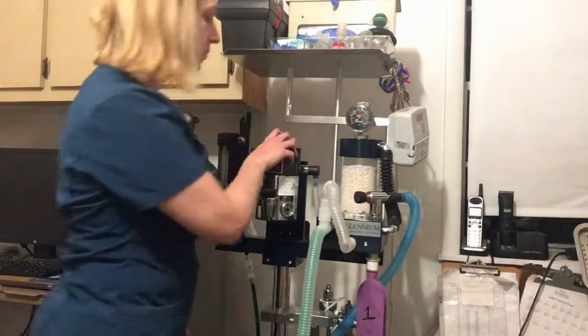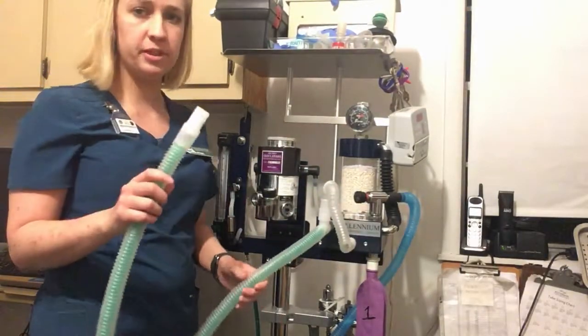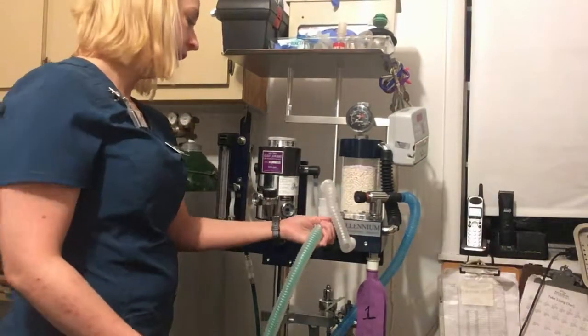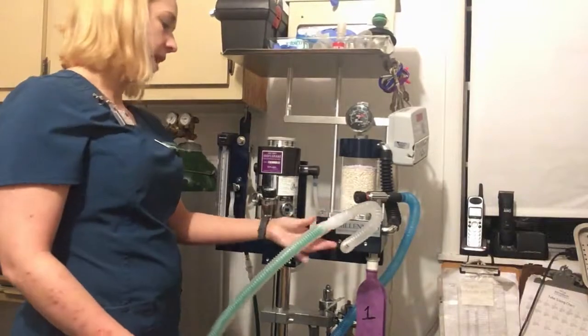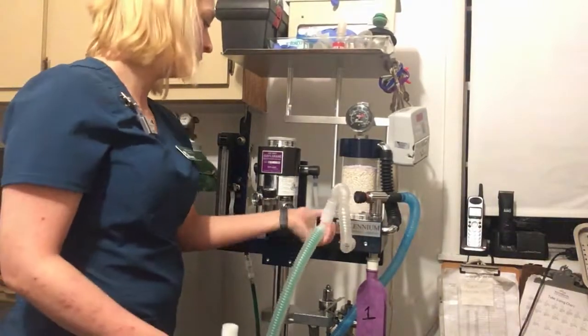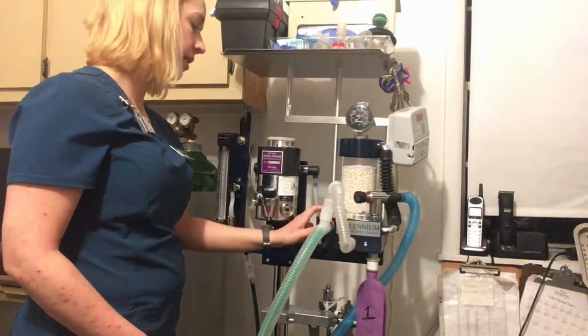Over here I have a rebreathing circuit attached right now. It is attached to the side that says inhale, and it has a sticker on here that says inspiratory, so that shows me that I need to put it right here at the inhale.